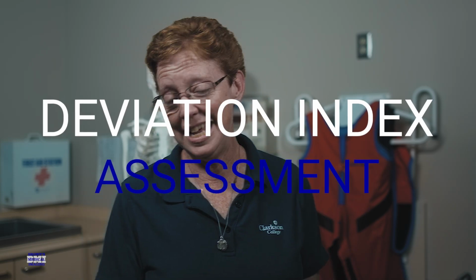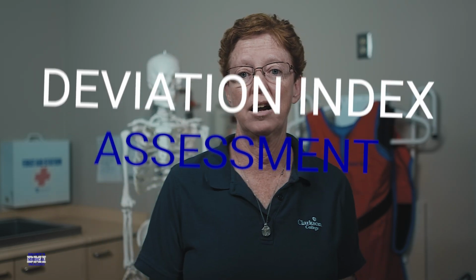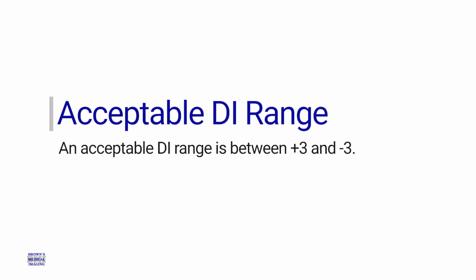Assessing the deviation index, or DI, is extremely important in radiography. This is our numerical assessment of whether our image is over or underexposed. An acceptable DI range should be between +3 and -3.